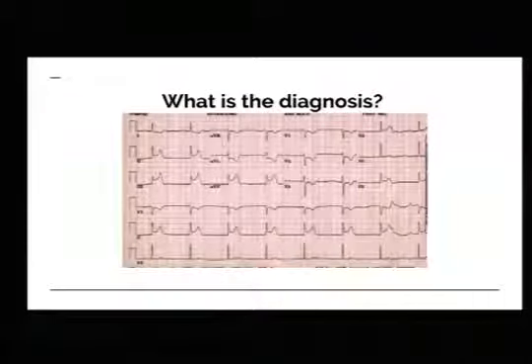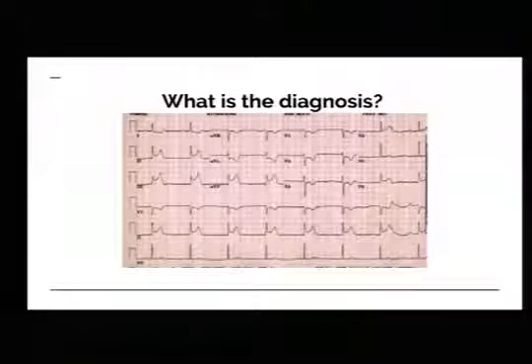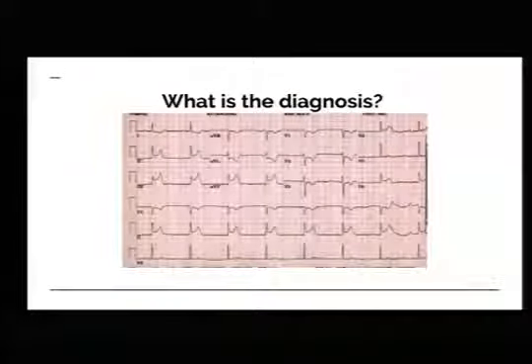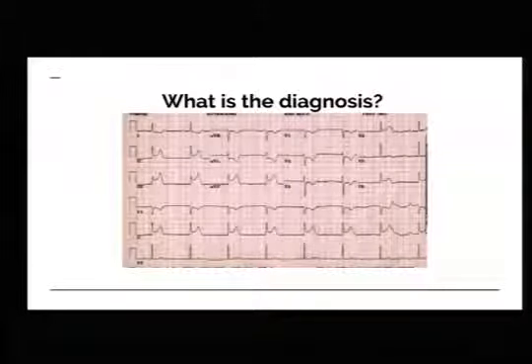What vessel is involved, or what region of the heart's involved? So you've got ST elevation in 2, 3, aVF. And you've got some nice reciprocal changes here in V2, V3. So inferior, right? What do you want to be cautious with here? Right. So what happens if you load them with nitro potentially? Yep, going to bottom out their blood pressure.